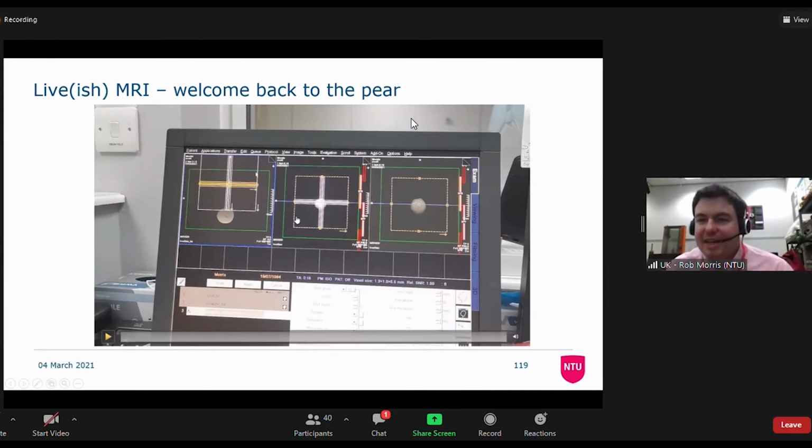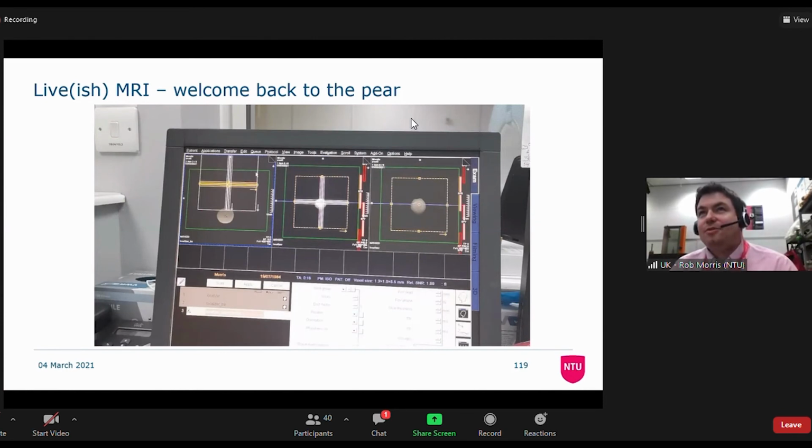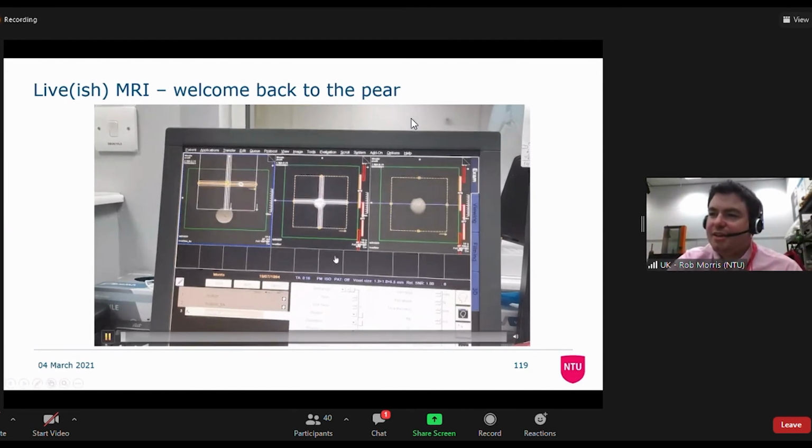On the MRI scanner, unlike with a benchtop instrument, you know that the sample is in the coil because you've put it into the coil. On the MRI, it could be anywhere in the bore. You just can't see where it is, and the scanner needs to know. So the first scan that we'll always do is called a localizer, and it just gives you a single slice on the system, and it knows where it's got a little laser crosshair, so it knows that it should start in the ISO center, like right in the middle of the bore, and then we have to line up everything else from there. So we're going to start with this from the first point.